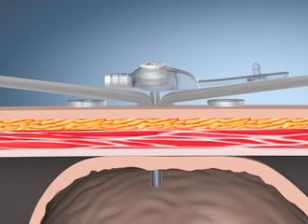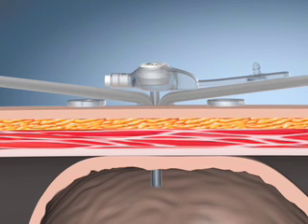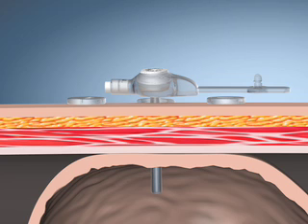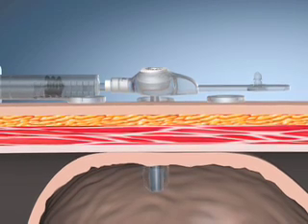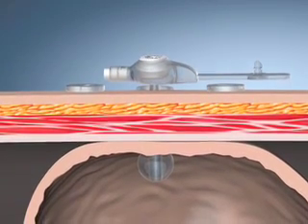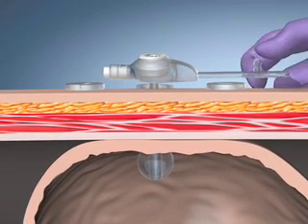After the gastrostomy tube has been advanced through the peel-away sheath and is in position in the stomach, peel the sheath away from the tube, remove, and dispose of according to facility protocol. Ensure the external bolster is flush with the skin. Using the 6 milliliter slip-tip syringe, inflate the balloon. Clean the residual fluid or lubricant from the tube and stoma.